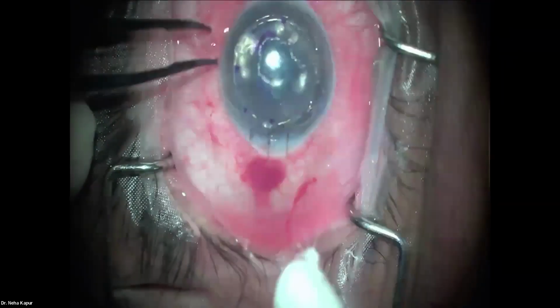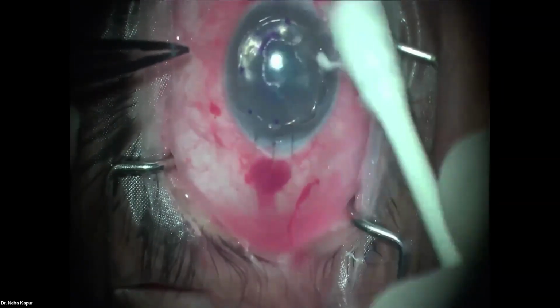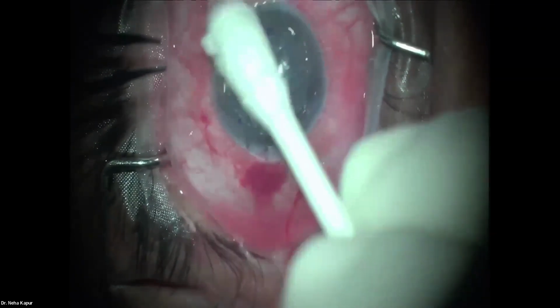So the epithelium was looking a little loose, so we're just taking out the epithelium. Yes, okay.